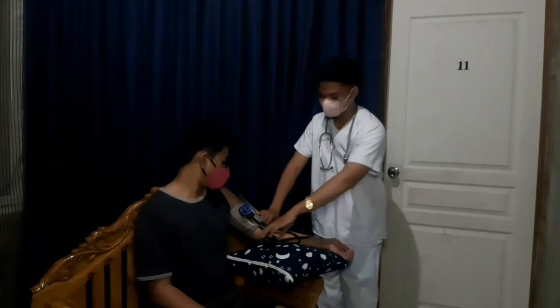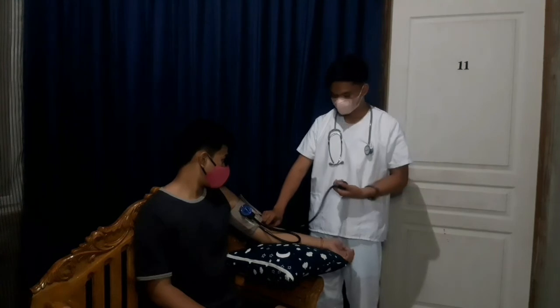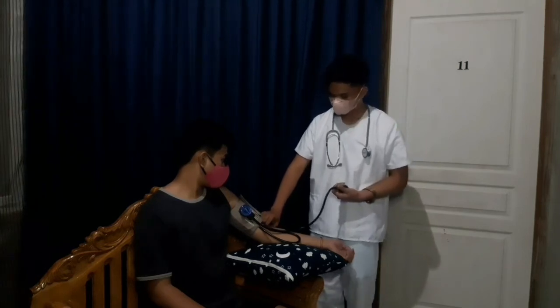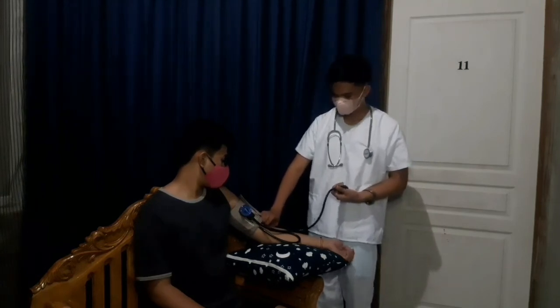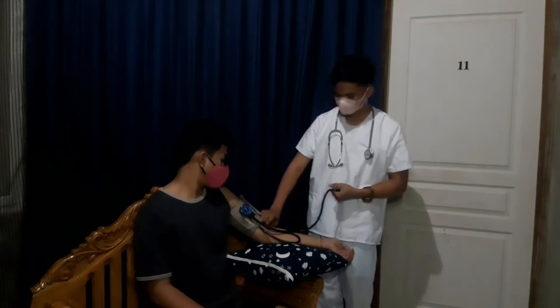Palpate the brachial artery with the fingertips. Close the bulb on the pump by turning the knob clockwise. Pump the cuff until you no longer feel the brachial pulse.